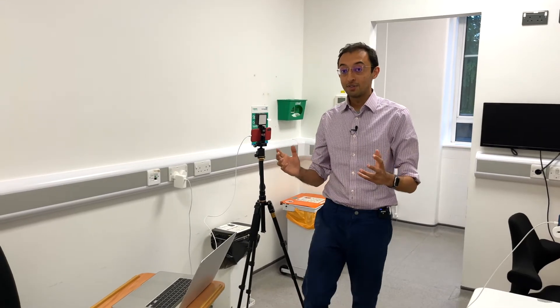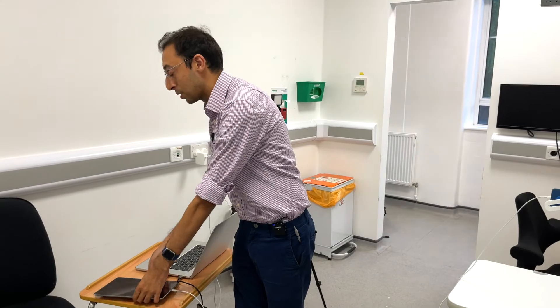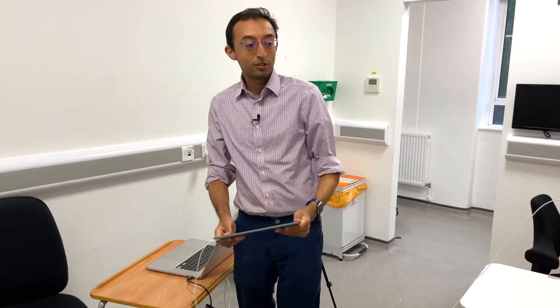The final camera we had was an iPad, which was also connected to the Camo app on the laptop and which we could hot swap between. This iPad allowed us to bring a camera really close to the patient's face for examinations including exophthalmometry and pupillary reflexes, which was really invaluable because some of the patients did have positive signs.